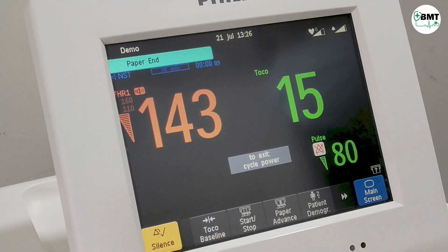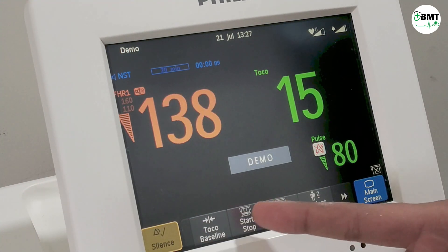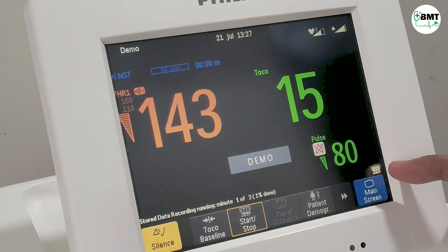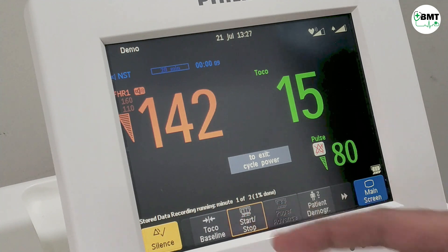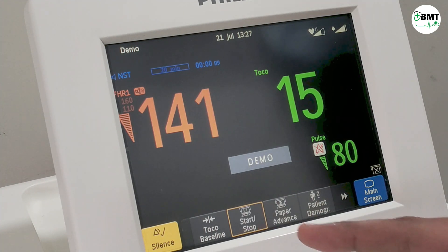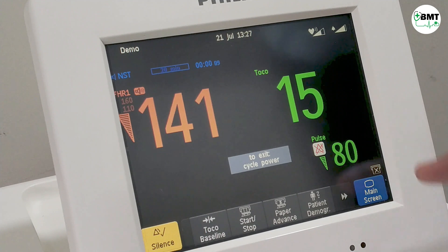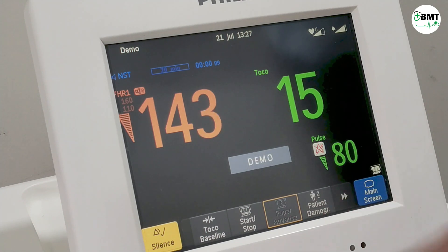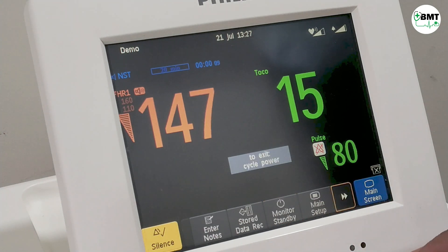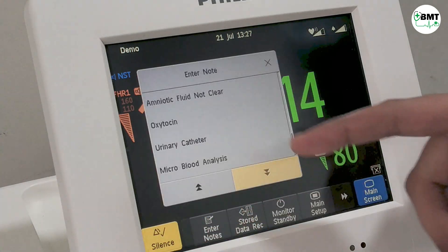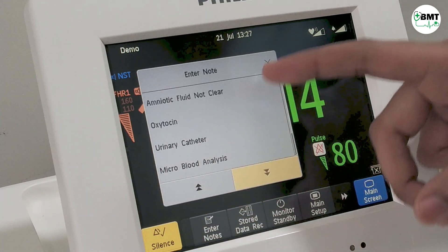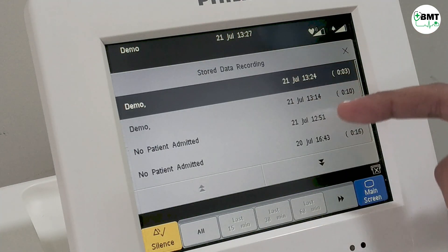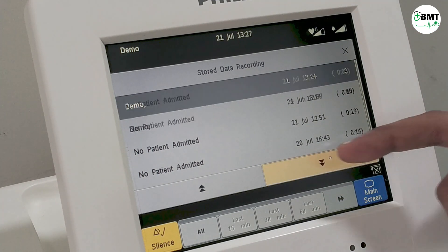To silence the alarm, press silence from here. To start the printout, press start and the printout will get automatically started — at that time the indicator will be in this color, and when you stop it, it will change. Patient demographics is also shown. Press paper advance for a continuous flow of paper. If you want to enter notes, notes can also be entered in the printout. Your data of seven days can be stored in this machine; after seven days it will automatically get deleted.